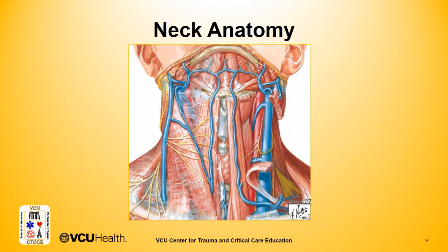Along the way, you should be palpating to keep yourself in the midline. So you can make a cut and then remove the knife and stick your finger in, and then take your finger out and put the knife in and go back and forth until you've cut all the way down and can palpate the larynx. You do not want to have the knife and your finger in the incision at the same time. This is dangerous, and you want to avoid situations where you may injure yourself.